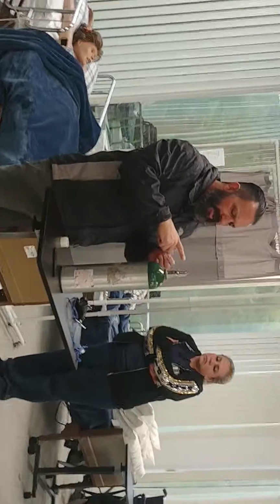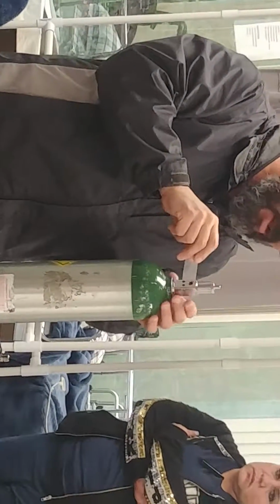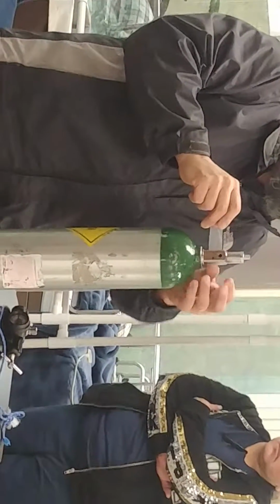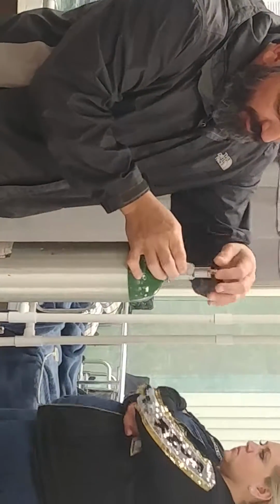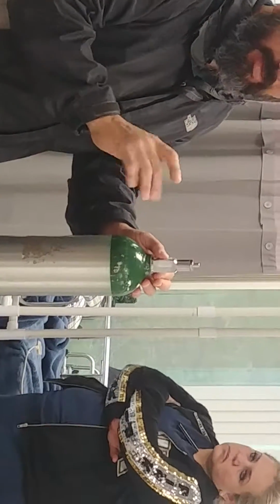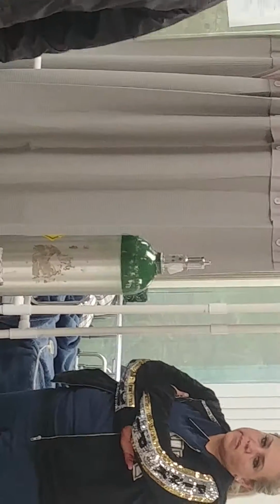Humor me and simulate this being a hard plastic safety tab wrapped around these. The reason is it lets us know it's still a new bottle and hasn't been tampered with. So this is what it's going to look like.